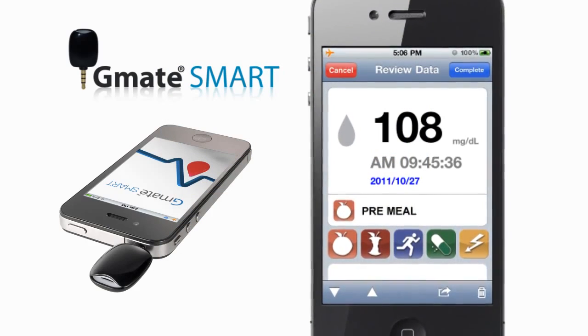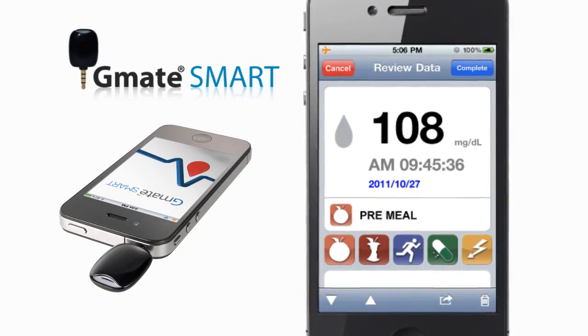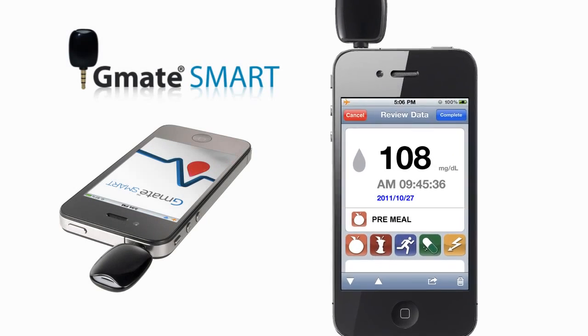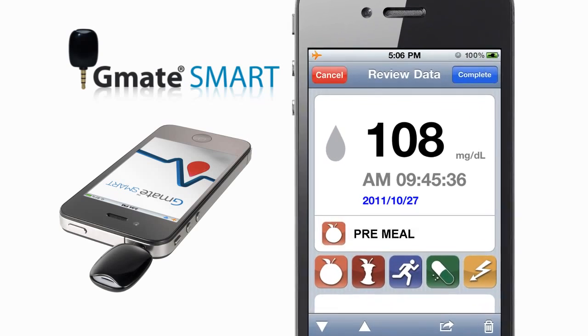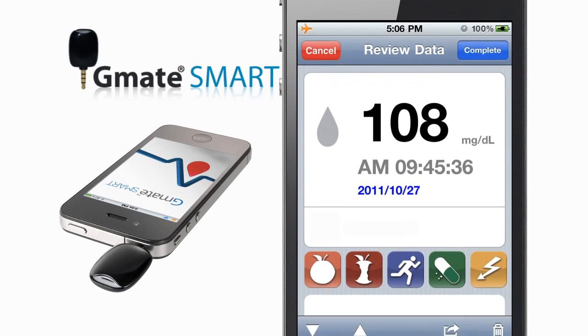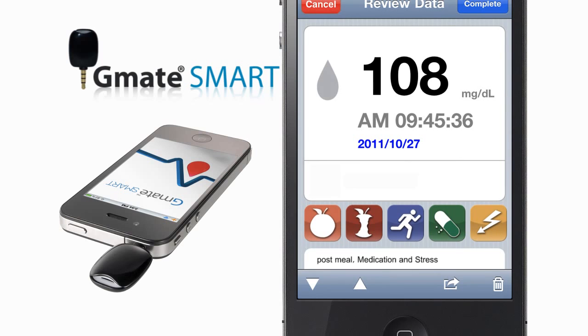Your blood glucose test result is shown on the display screen and automatically stored in your smartphone. You can add a note to a test result by selecting an icon, such as pre-meal, post-meal, exercise, medication, and stress, or simply by typing a custom comment.